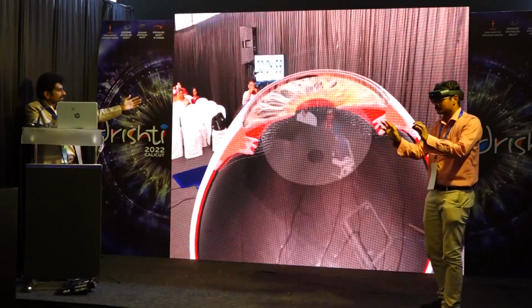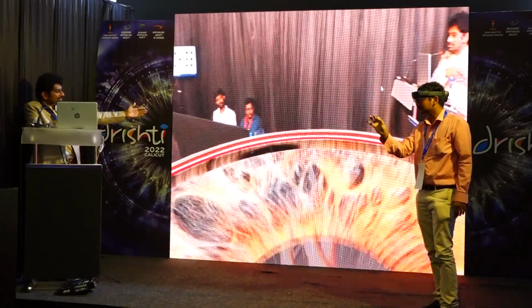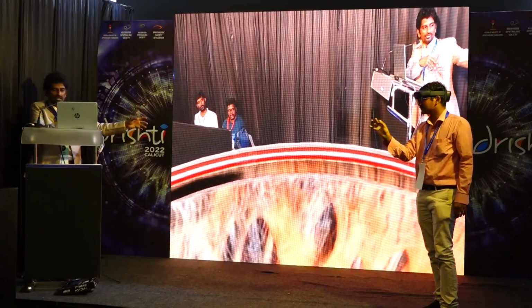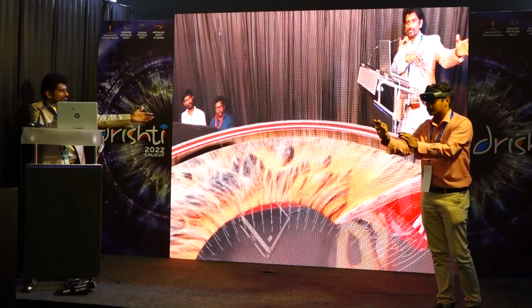Yeah. So this is like in telemedicine, we are trying to work on an EMR as well, where you can see that my dear friend is examining the angle structure. Not only the angle is seen in one particular frame of choice, it can be seen in any view. Can we have the side angle view and the magnified view so that the electron microscopic view is also shown?